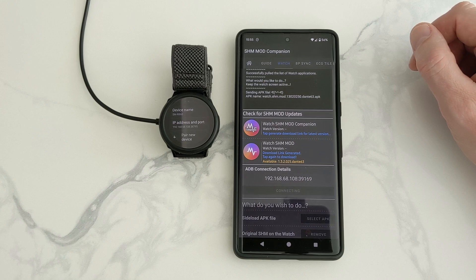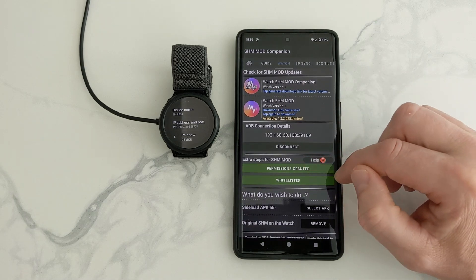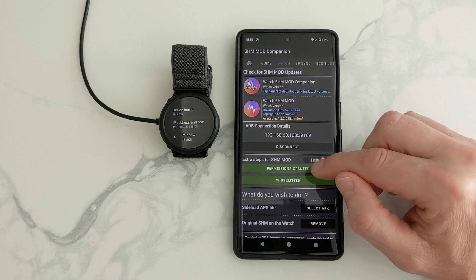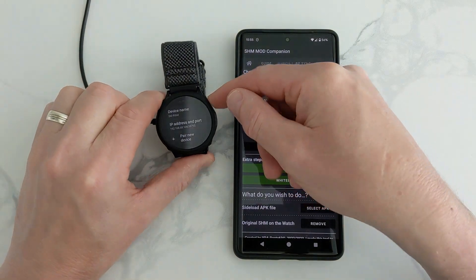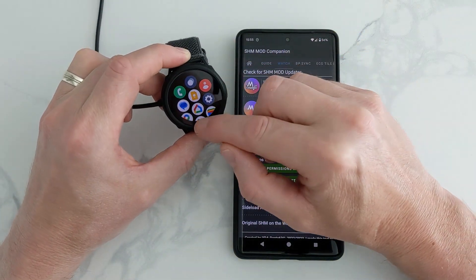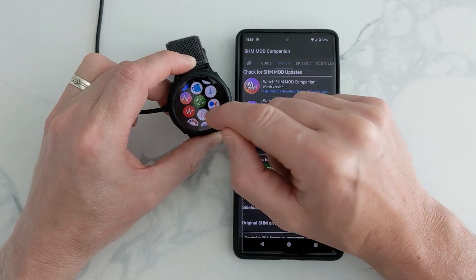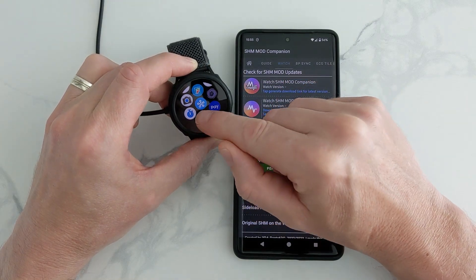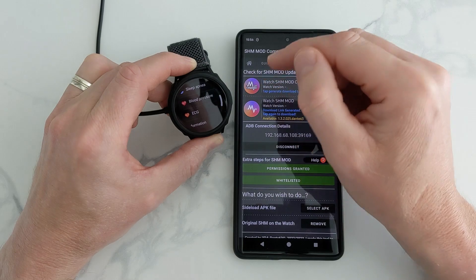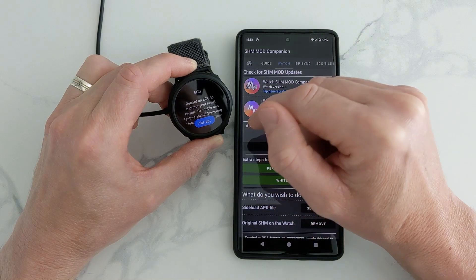This bit could take a while, just be patient. And that's it — done. You might have to grant permissions and whitelist the app, you might not. Once that's done, we can back out of the Settings on our watch and we can find the new app that we've just downloaded, which is there. It looks very similar to the Samsung one. So this is the Samsung one — it won't work because I've got a Google phone, you've got to use the Samsung one. But with this modded app it comes straight on. Now like the blood pressure, you would need a blood pressure machine to calibrate it. ECG you can do that there.